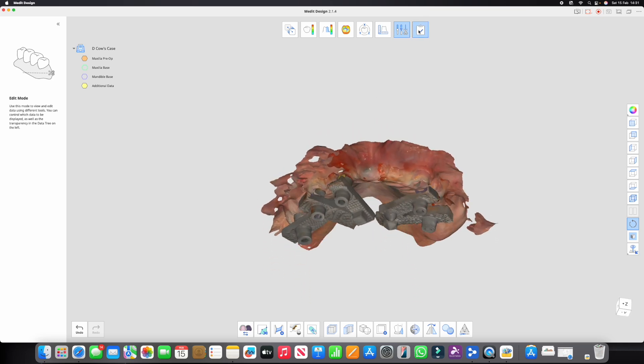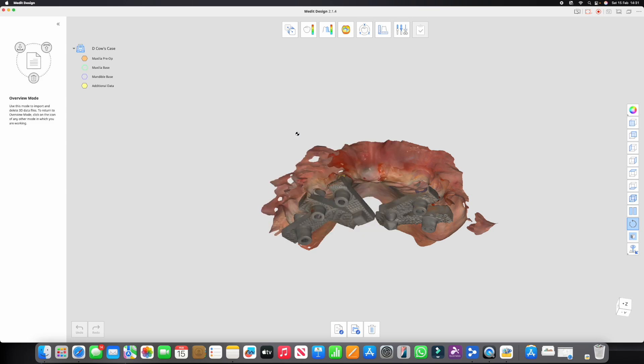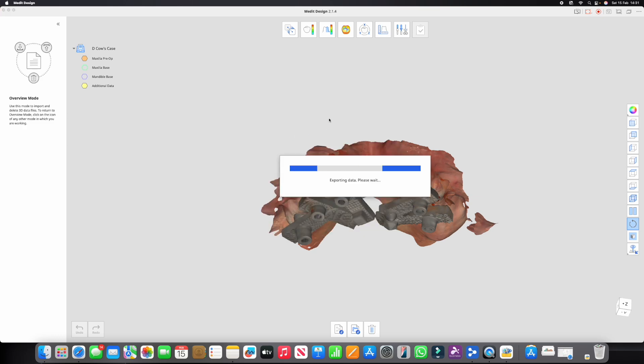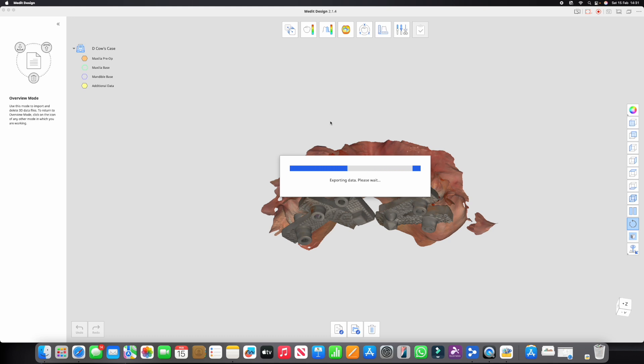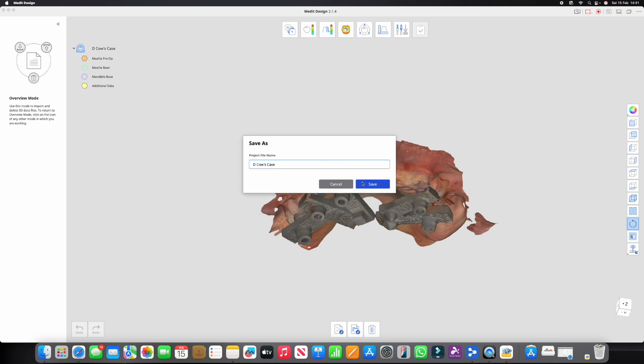So now we need to go out of here. I'm just going to click complete, overwrite the existing files. And if we go back into MeditLink once it's exported, it should show everything in the correct position again. So we're going to click exit program after saving.